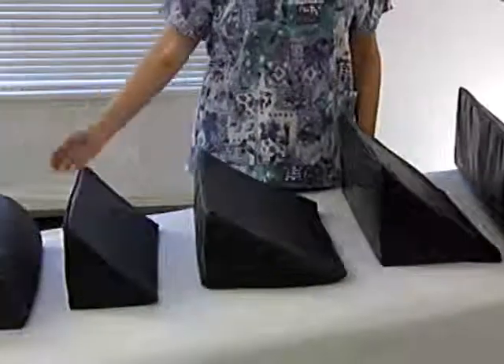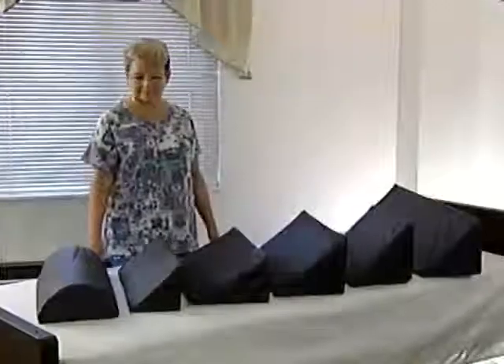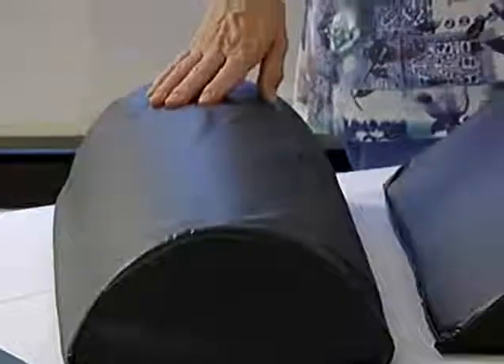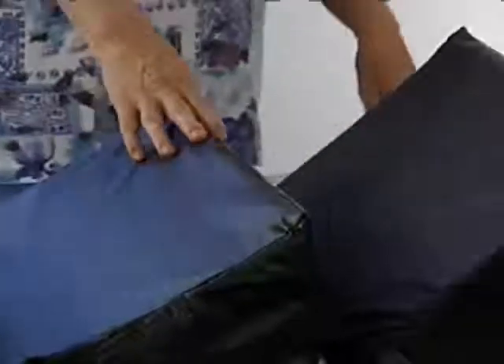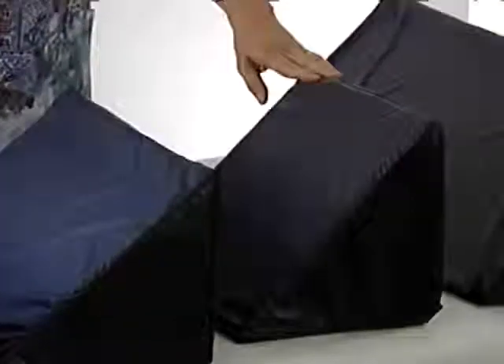All of our Tough Guy Trunk Positioners can be cleaned and used on multiple patients. Here you can see the Tough Guy Trunk Positioners: the roll, the small trunk positioner, the 30 degree, the standard trunk positioner, and the short trunk positioner.